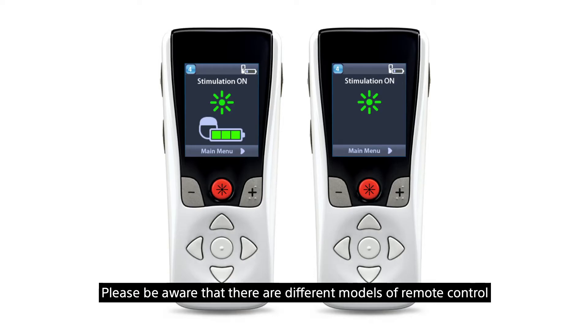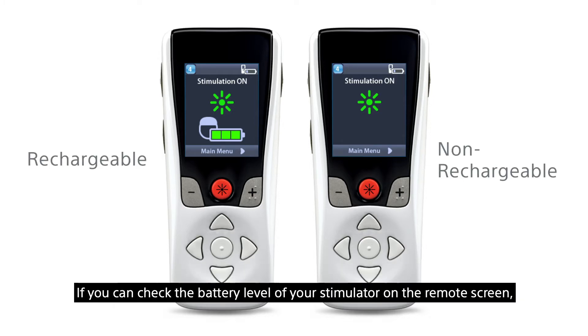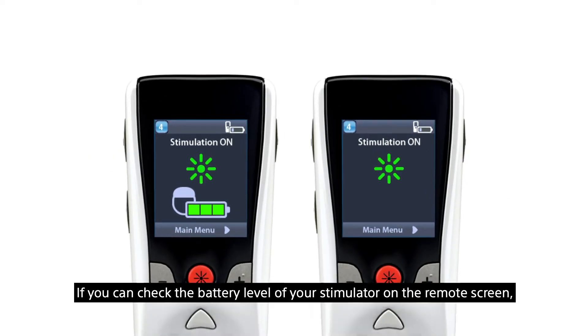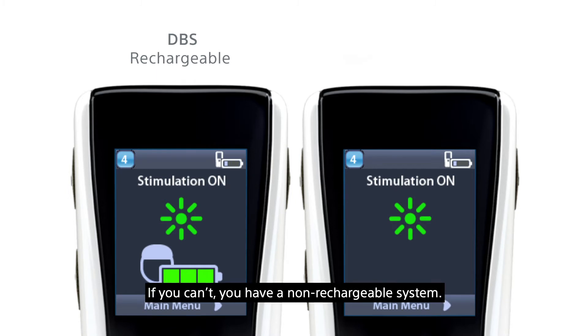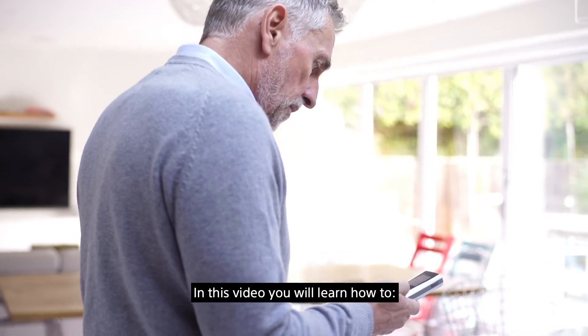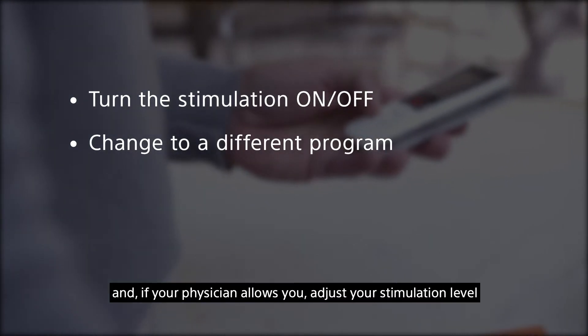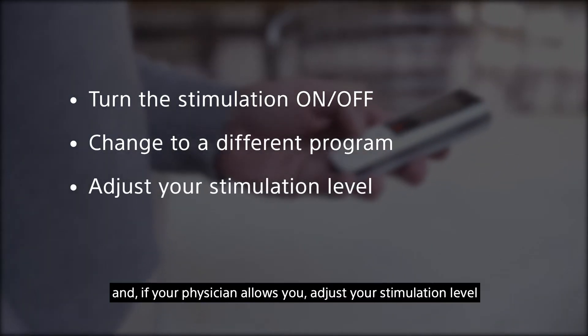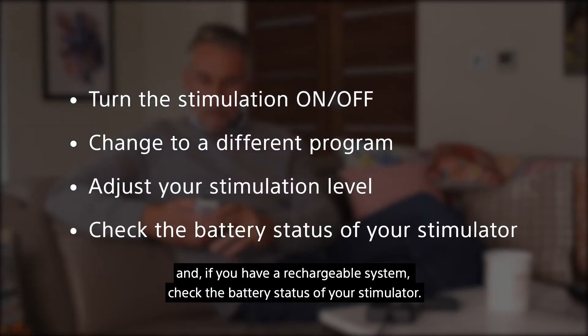Please be aware that there are different models of remote control depending on whether you have a rechargeable or non-rechargeable DBS system. If you can check the battery level of your stimulator on the remote screen, you have a rechargeable system. If you can't, you have a non-rechargeable system. In this video you will learn how to turn the stimulation on and off, change to a different program, and if your physician allows you, adjust your stimulation level. If you have a rechargeable system, you can also check the battery status of your stimulator.